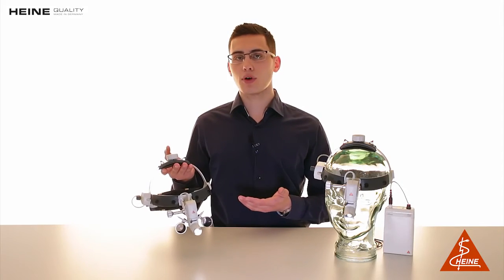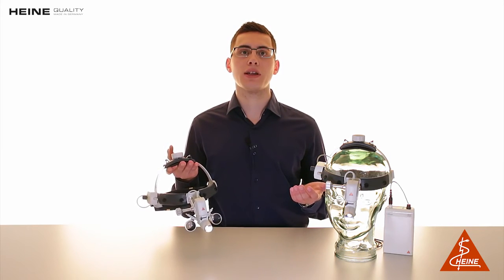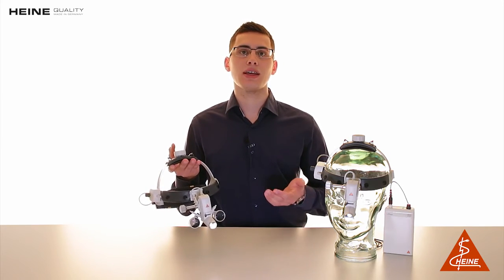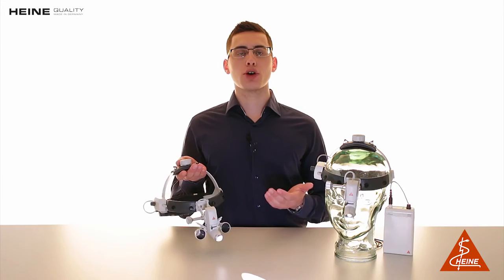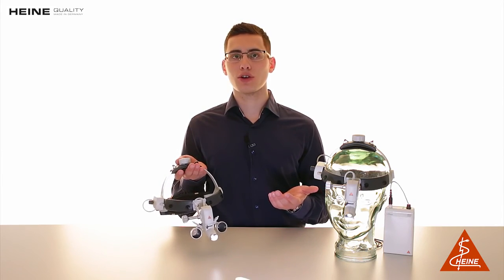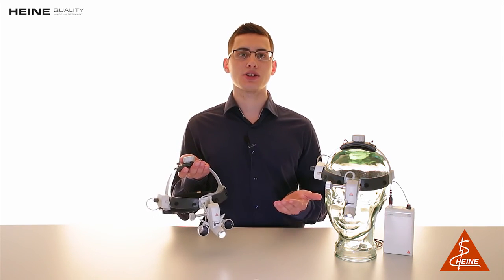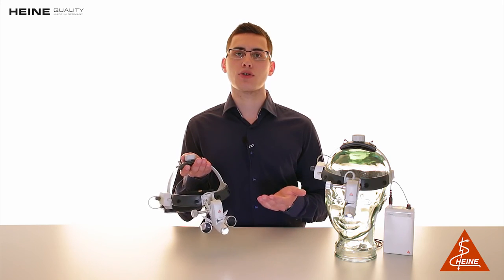The ML4 LED is the ideal choice for anyone who needs perfect illumination of a given area, even for longer procedures. It is our top-of-the-range headlight featuring coaxial illumination, homogenous and bright light, adjustable spot size and comfort — all in Heine quality — to ensure your Heine ML4 LED headlight works the same way in five and ten years as it did on the first day you took it out of the box.